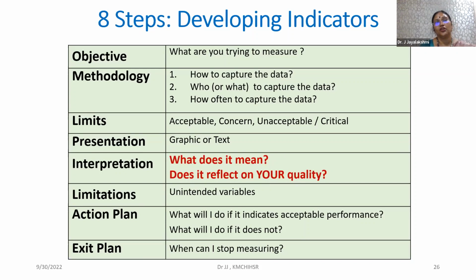Does it mean that your bottles are not being preserved very well? Is it because they are not cleaning the site very well? What is that going to tell you? What are the unintended variables? Sometimes your patient actually has an infection with coagulase negative staphylococci, but we have probably considered that as a skin contaminant and said, okay, this is contamination. So there may be something like that also. So you always need to be looking out for those which may not be the routine, the regular.